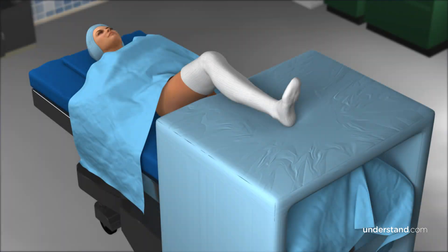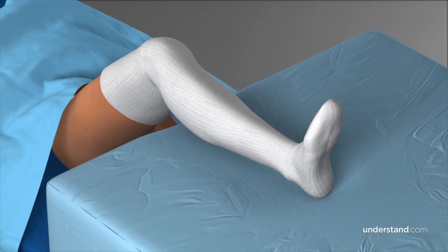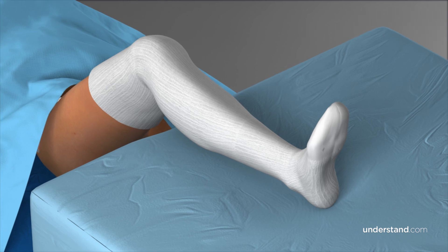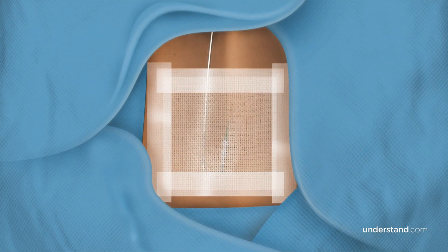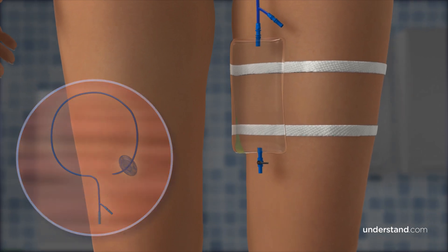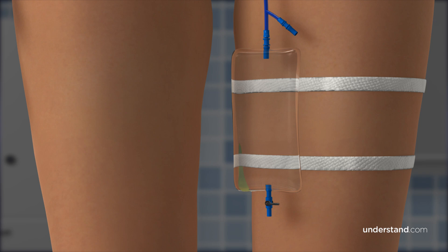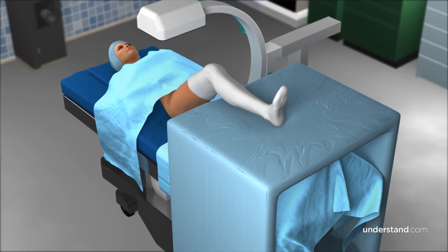Prior to a PAO procedure, you will meet your preoperative and surgical team. They will make sure you are ready for surgery, insert an IV, and apply compression stockings to reduce the chance of blood clots in the legs. Once in the operating room, you will likely undergo regional anesthesia, in which a small tube called an epidural catheter delivers medication to the spinal column, numbing you from the waist down. A catheter will also be inserted into your bladder to collect urine and will remain for a day following the operation. You will be carefully positioned on your back, with your arms and non-operative leg positioned with padding. The surgeon will use a portable x-ray device over your hip during the surgery to confirm the position of the bone cuts and to guide the correction of the hip socket, confirming it is in the optimal position for your specific anatomy.